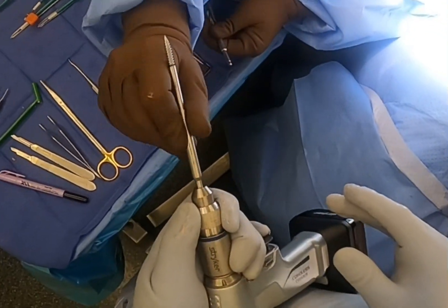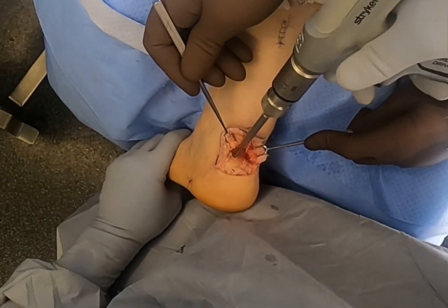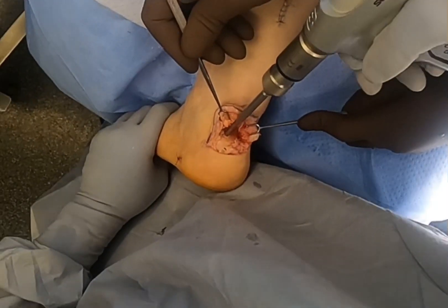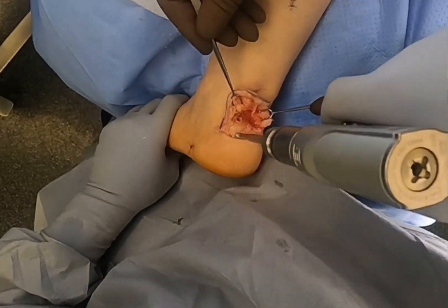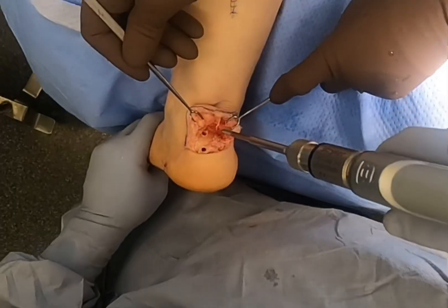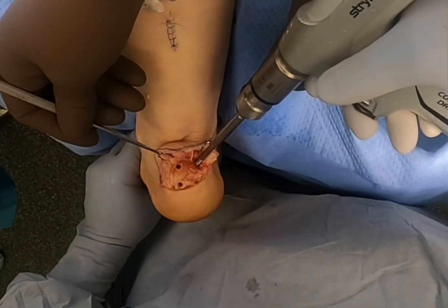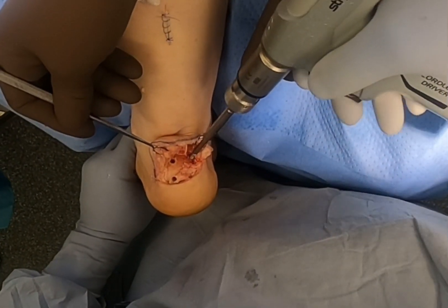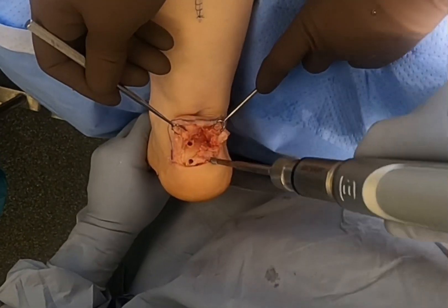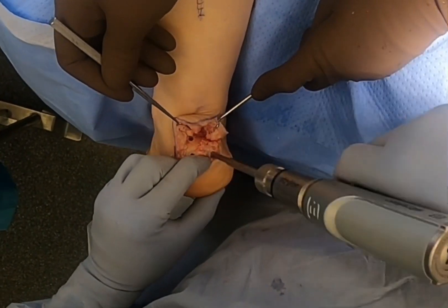Here's the tap. I power tap — some people hand tap. When I power tap, I just pulse it and let it catch the hole and the angle of the hole, and then it goes in on its own. It's much quicker than hand tapping. You don't just pull the trigger and go — I pulse it to get it to find the actual angle of the drill hole, and then it pulls from there. Much better and much quicker than hand tapping.